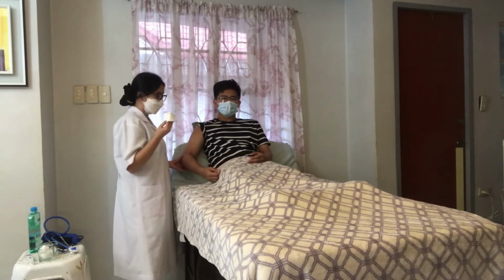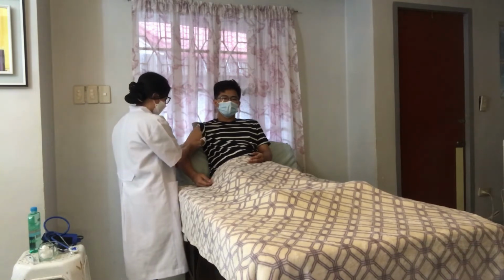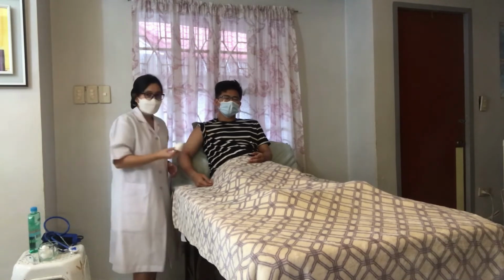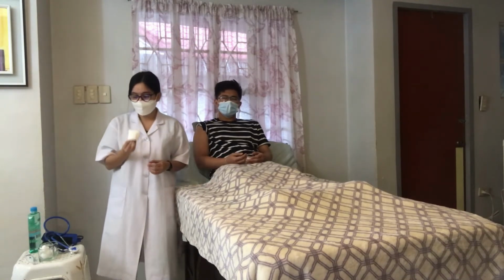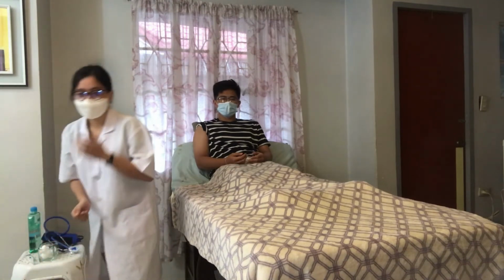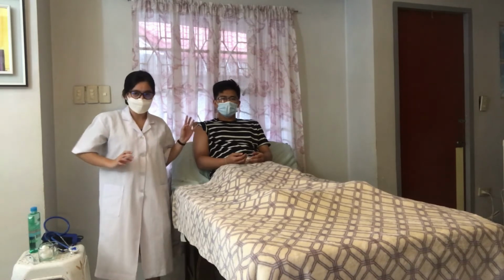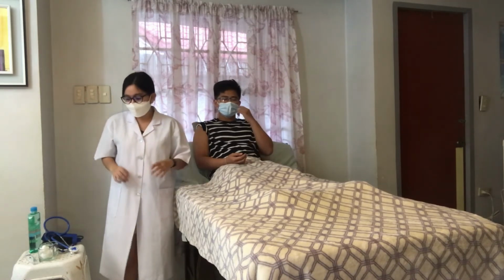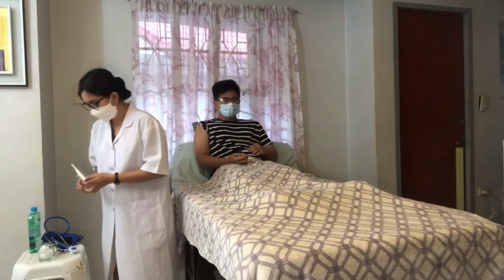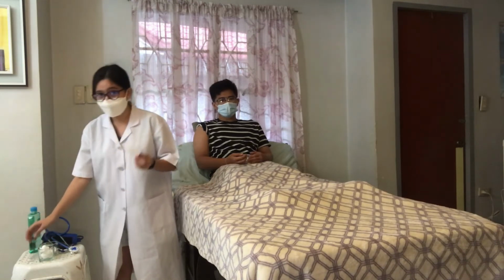Now we are going to dry the patient's axilla in a patting motion. And then after drying, we have to discard the paper towel. Now that we have dried the patient's axilla, we are going to get our thermometer. We have to remove it from the container and then disinfect the thermometer.